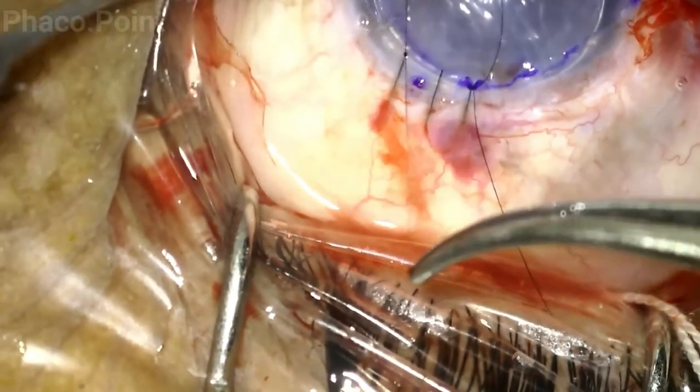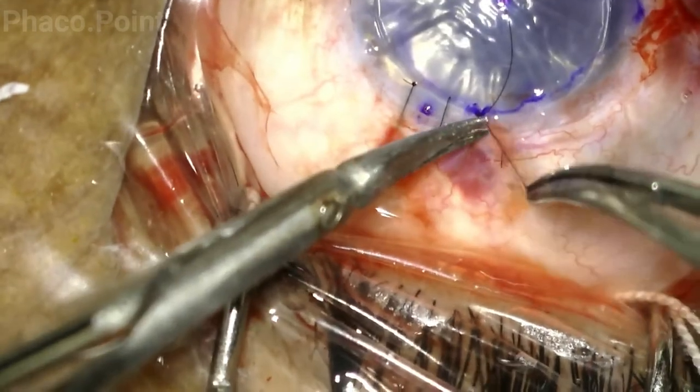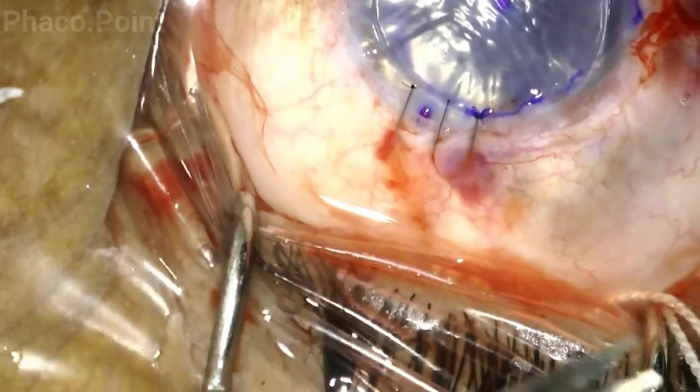Always ensure that you have a well-formed eye when taking the sutures, as this gives you the correct level of tautness, thereby avoiding an end result which might be too tight or too loose.